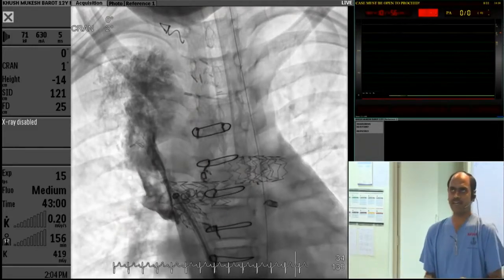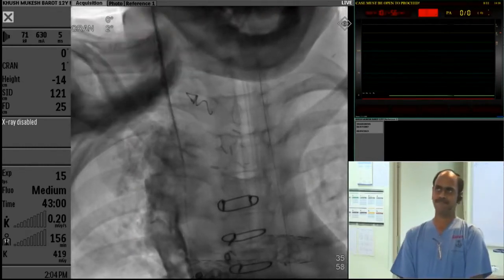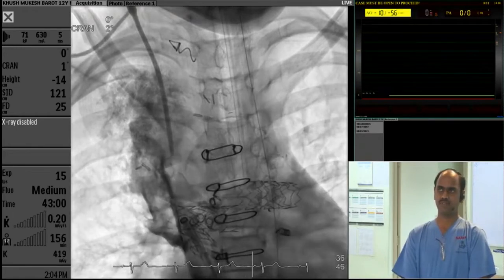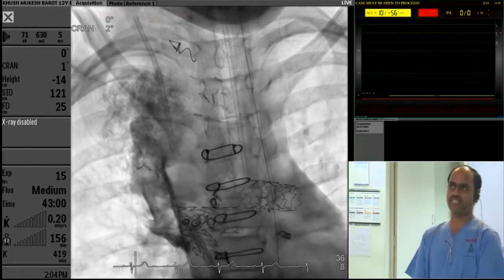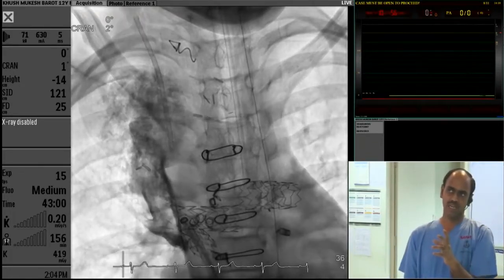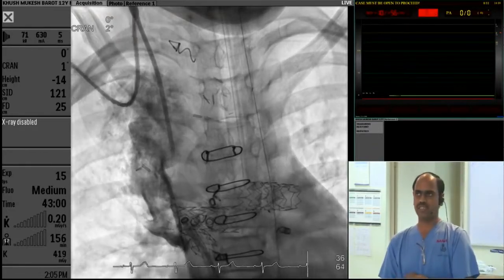The next step I did was I took a neck puncture. I went in with a sheath and injected. There is a retro-aortic innominate vein in this patient — there is a right aortic arch, and what you are seeing is a retro-aortic innominate vein below the right aortic arch.